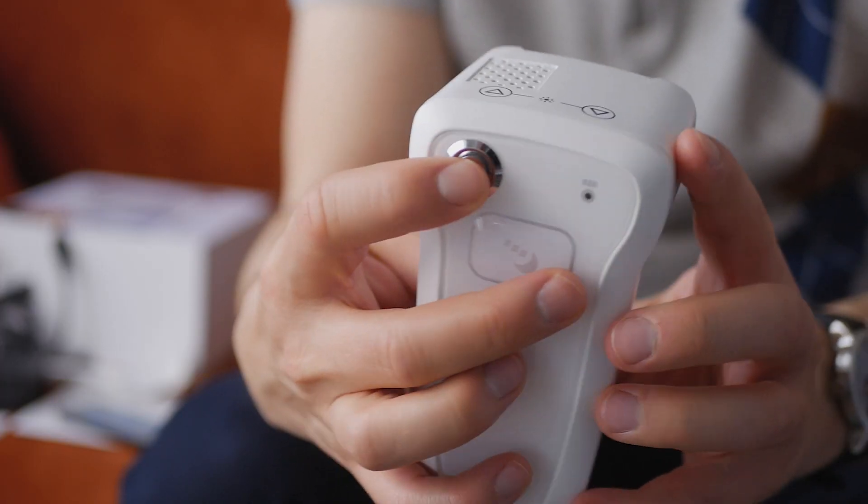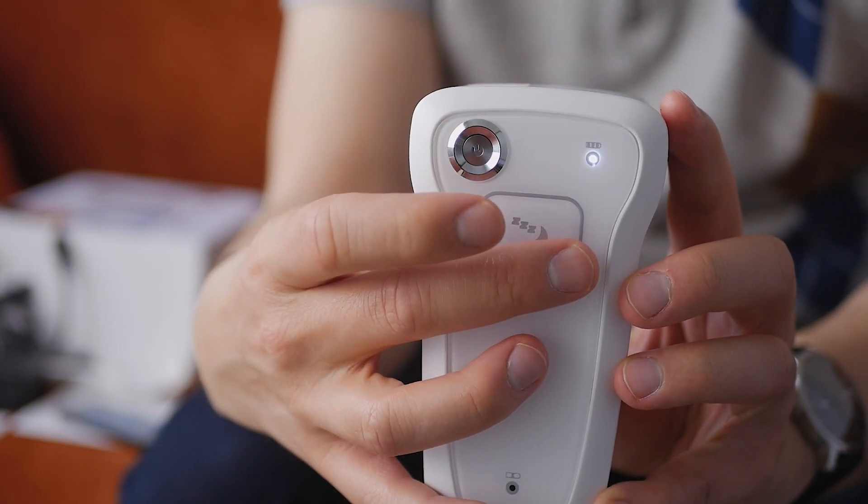So this is what a vein scanner looks like. It's not really heavy — I would say it's light. The company said it works in a really easy, simple way. You just have to click on the power button.